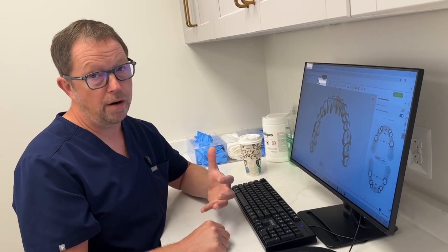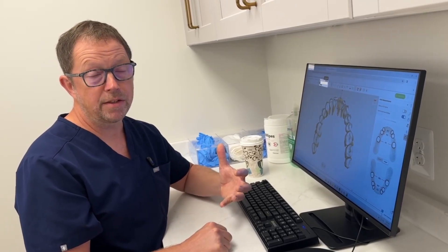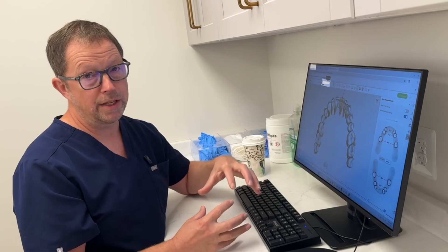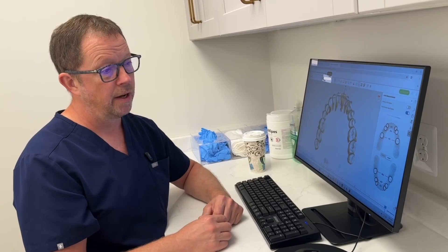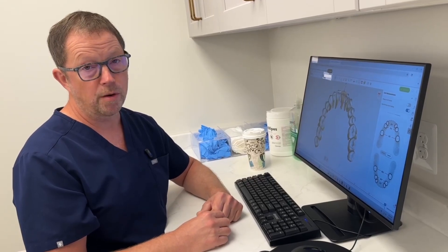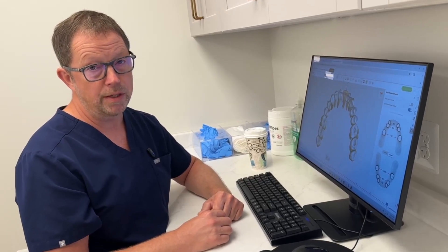We looked at the bottom jaw first, and that's the rate-limiting step. We plugged that number into the top, and in the end we have a case where we can get good occlusion, good tongue space, and about 41 millimeters of intramolar width. And that's how we do these cases.